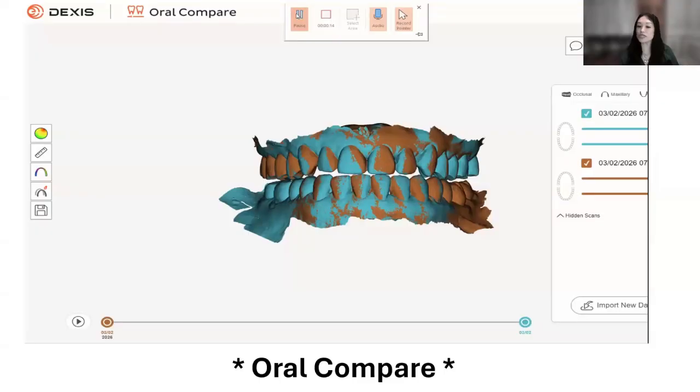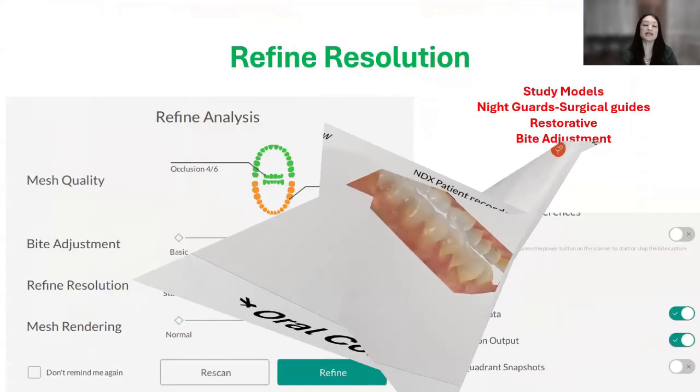Or how about when they chip their teeth 8 and 9 because they need a night guard, and we've told them for 20 years that they needed a night guard, and then Mrs. Smith comes back and says, you know, number 9, I chipped it a little bit more since the last time you saw me. And you're like, I've been telling you for 20 years, I know you grind, you have other signs, and yes, you do chip your teeth, but I don't know what happened from 6 months ago when you got your teeth cleaned till today. But to be able to overlay and truly see that she is chipping 8 and 9 a little bit more. And then Mrs. Smith turns to you and says, you know what, can you make me a night guard? It's a rinse and repeat. We've told her for 20 years, but until she validated and saw it, she told us what she wanted to do. Incredible the things that we can do now.